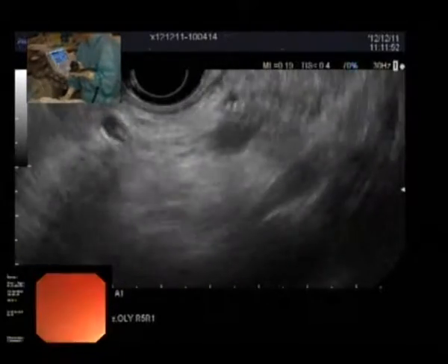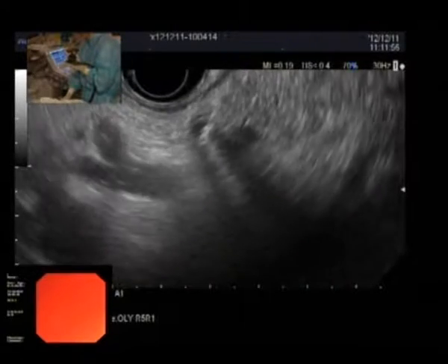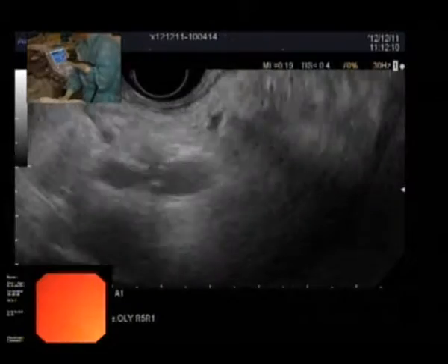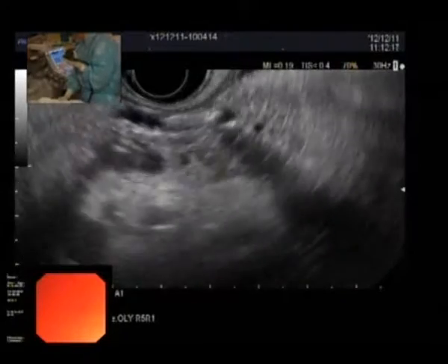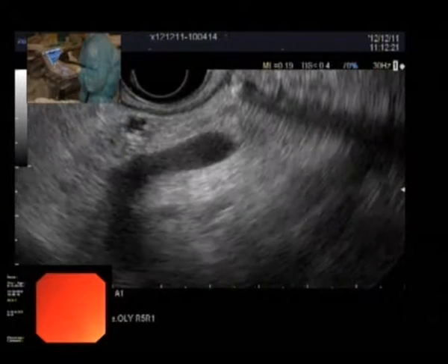We are looking at the pancreas here, and we can see some vascular structures. This is the celiac axis, coming from the aorta around this area, celiac, and the splenic artery goes like this, and this is the common hepatic artery. So if I trace the splenic artery, we can go. This is the splenic artery. Can you identify the splenic artery here?